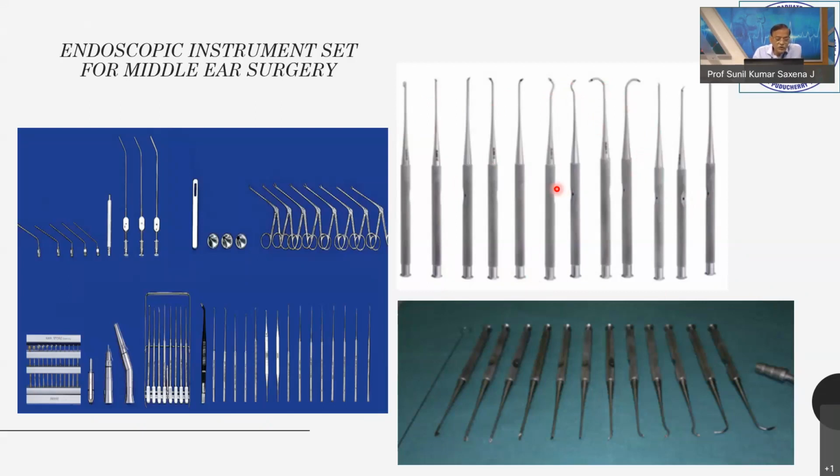So as your mastery and technique improve, you will try to go beyond myringoplasty, then definitely these instruments will be required. And second, with these Panetti instruments, the holding is very easy.